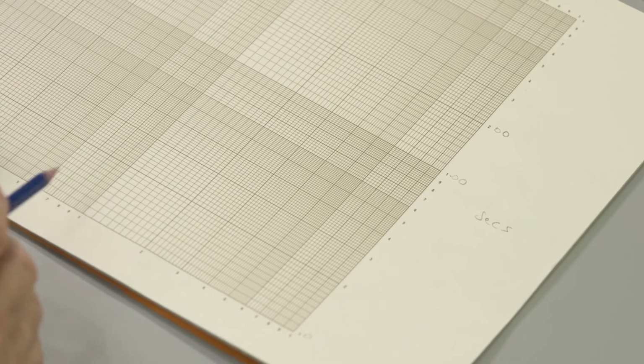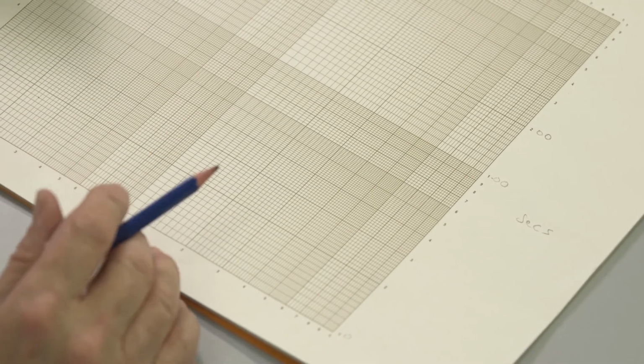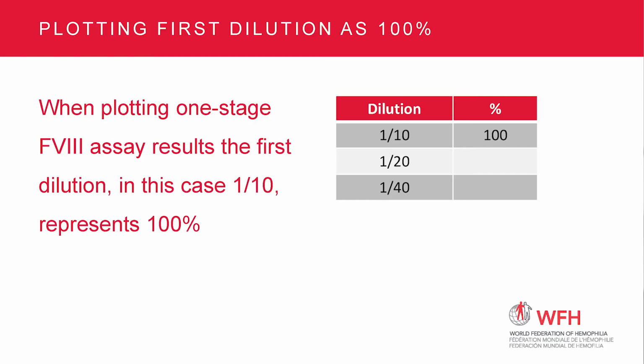Concentration. This we will derive from the dilutions. Whichever is the first dilution, in this case 1 in 10. Perhaps with another reagent set it might be 1 in 5, with even a different reagent set it might be 1 in 20. On this occasion the first dilution is 1 in 10. For the purposes of plotting, it's conventional to take the first dilution, in this case 1 in 10, and use that as 100% for the purposes of plotting.